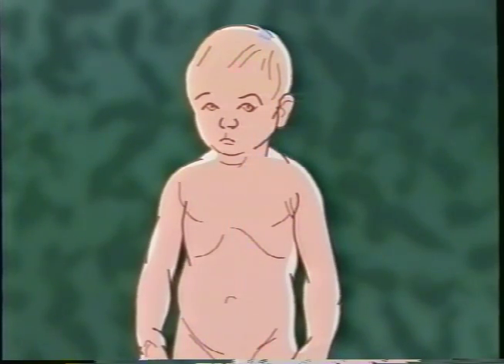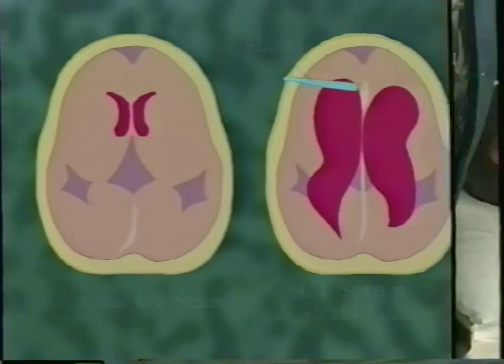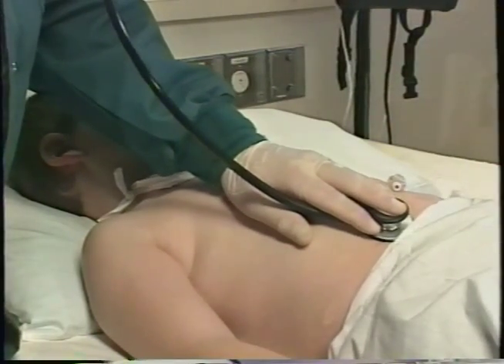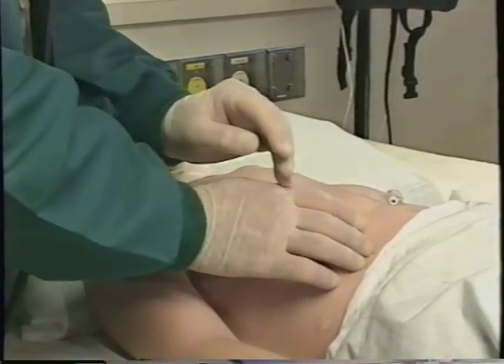Cerebral spinal fluid, or CSF shunts, drain excess fluid from around the brain. The excess fluid flows into a subcutaneous reservoir under the scalp through a subcutaneous tunneled catheter. This usually drains to the peritoneal space. Alternate drainage sites include the pleural space, right atrium, and gallbladder. A child whose CSF shunt is not functional can develop increased intracranial pressure, necessitating emergency action. Additionally, fever, abdominal pain, nausea and vomiting, or tenderness at the shunt site could reflect a shunt-related infection.